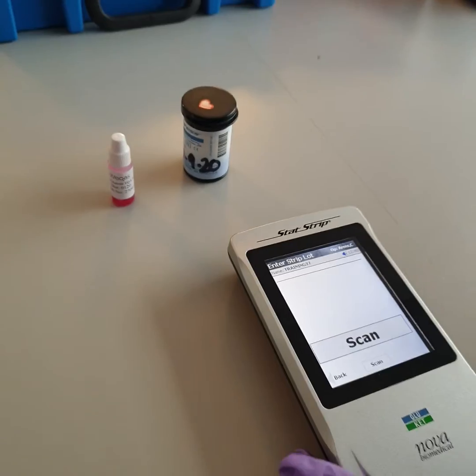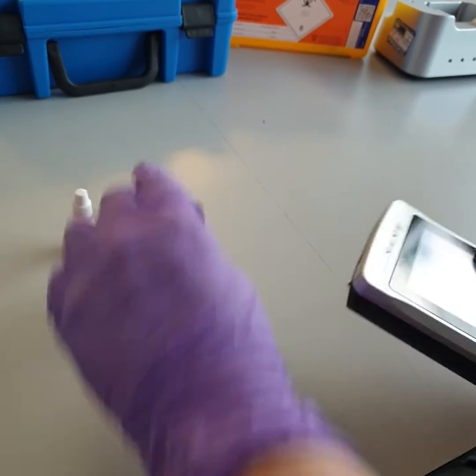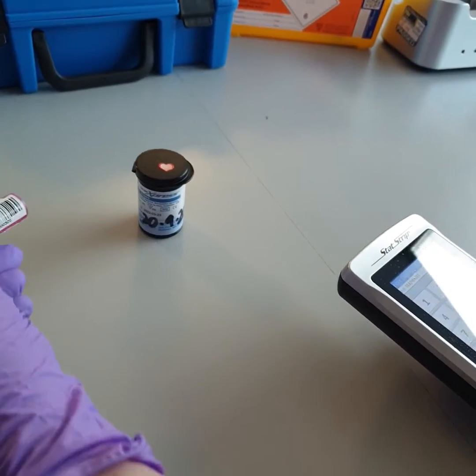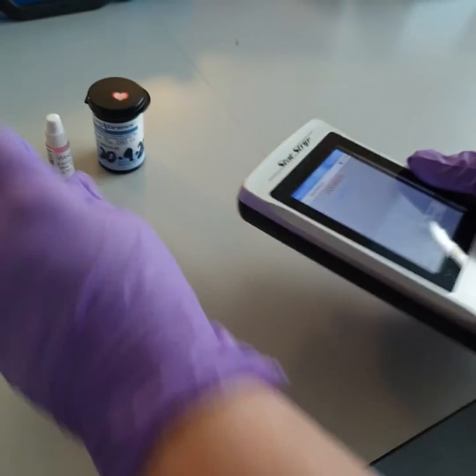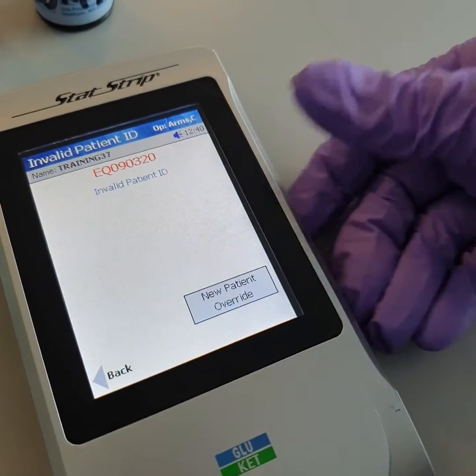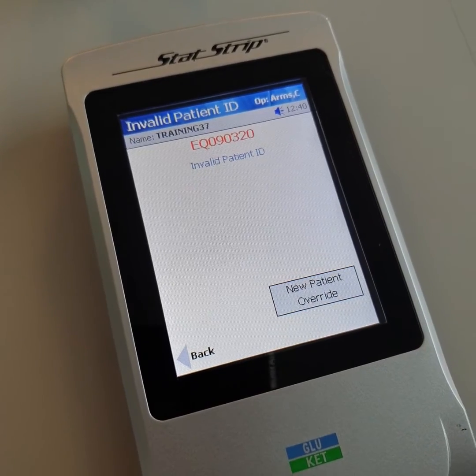Enter the strip lot by scanning the barcode on the strip pot. Enter the distribution number by either scanning the barcode on the bottle or manually inputting the number using the keypad. The on-screen details will confirm you've scanned an EQA sample.